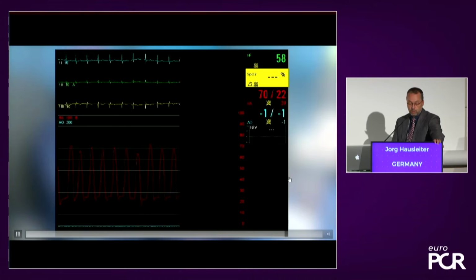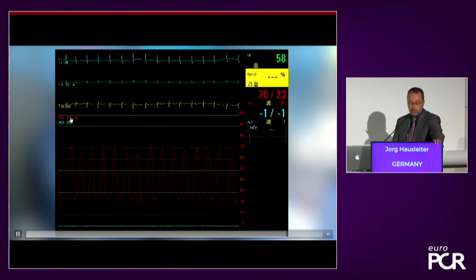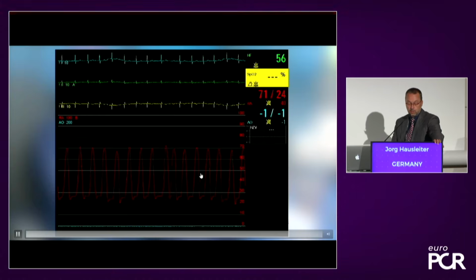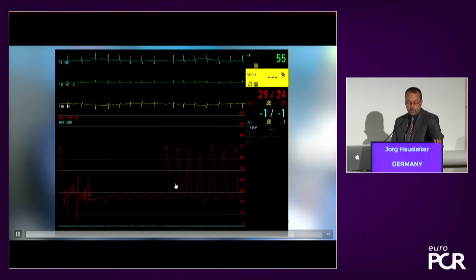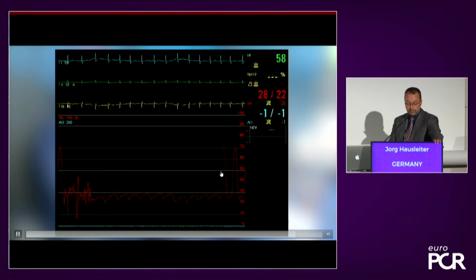And what you can also appreciate is the hemodynamic response. With this placement, you get a significant further ventricularization of the right atrial pressure. Now the right atrial pressure in systole is around 70 millimeters of mercury. But in a second you will see that I'm pulling back the catheter below the stent into the inferior caval vein, and you see the significant pressure drop. So they have a good separation of the right atrium to the lower body half.